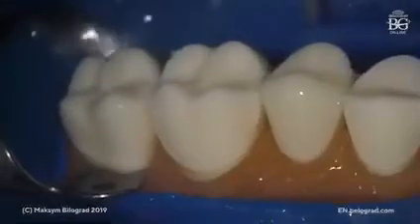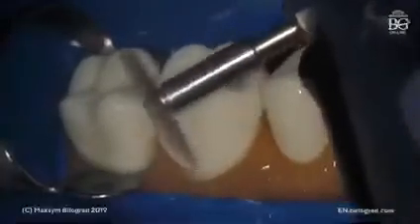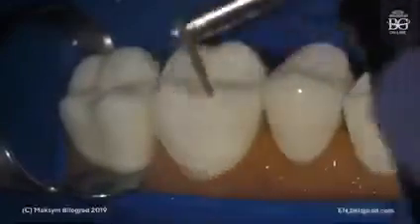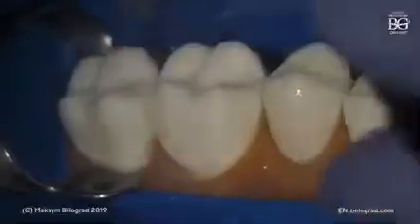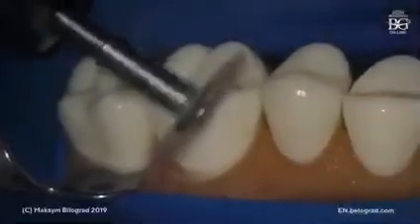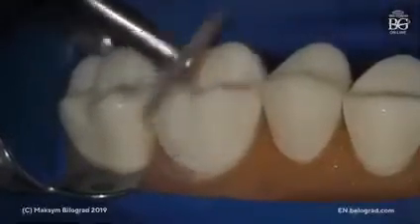You can even switch it off or just have it really little bit, 5000 RPM, and the abrasive part of the disc is here, is internal, and just move your disc over the surface, this transition from buccal surface and finish lines. What is important for the disc is not to touch the finish line. This is important, because if you touch the finish line with the disc, there will be no finish line.